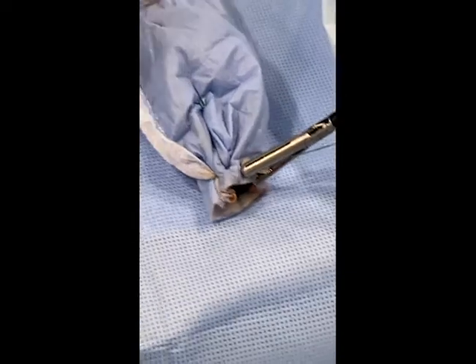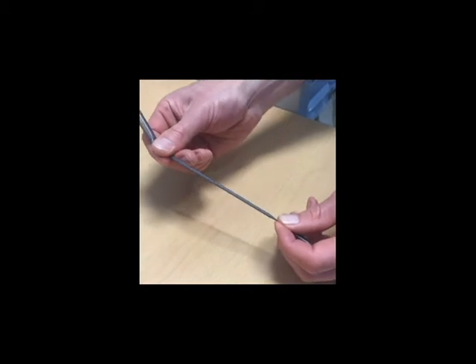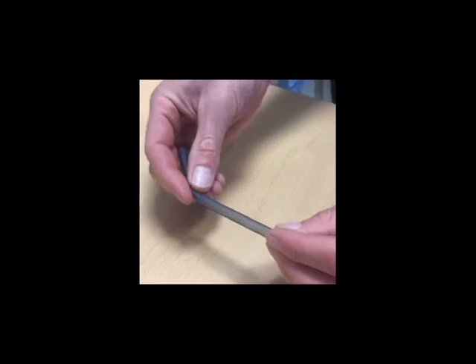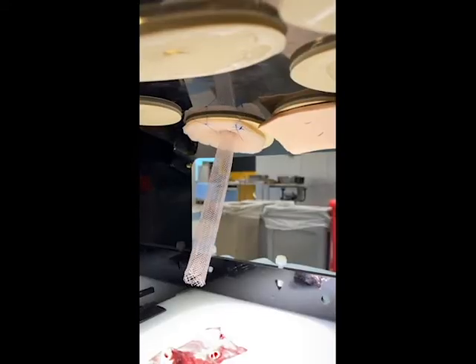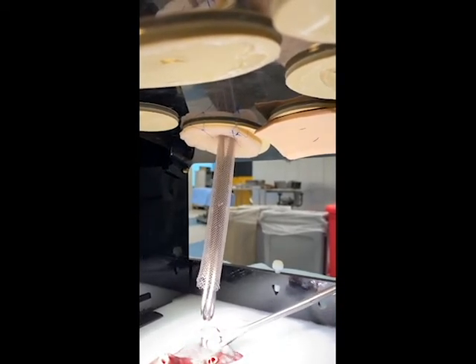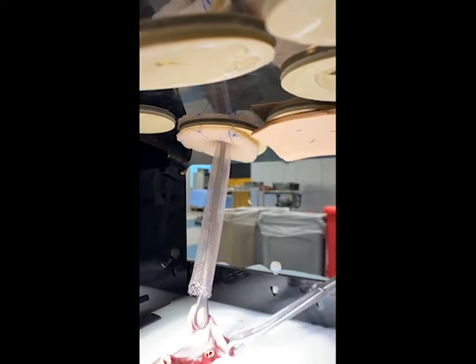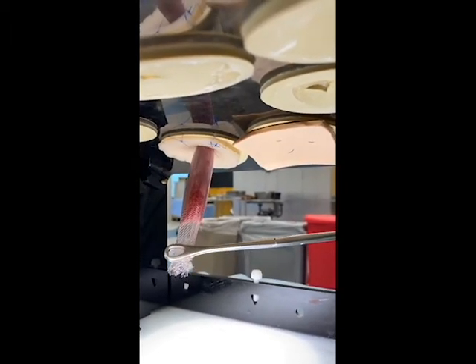This final material is a braided mesh with a coated layer, so it's all the same layer, same coating. It works very well because it compresses — it has a higher compression ratio. And as you'll see here, as soon as the specimen is incorporated into it, it is extracted very easily.